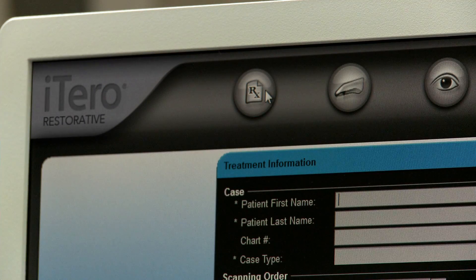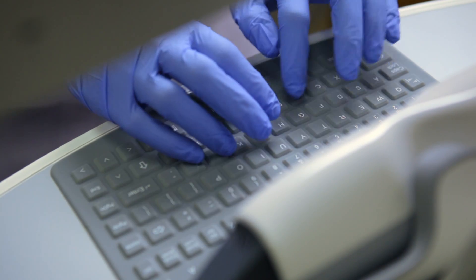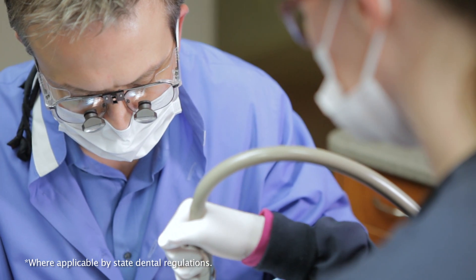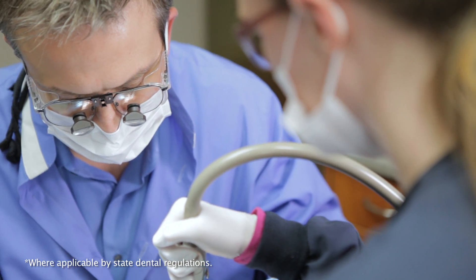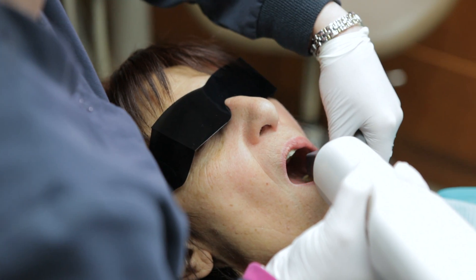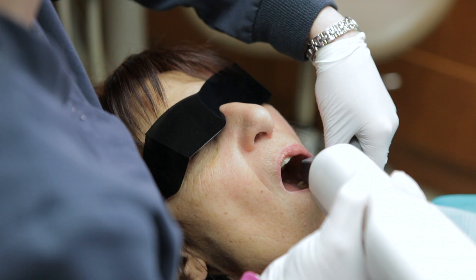Scanning for restorative treatment begins with a simple prescription form on the iTero system and an opposing arch scan. Both of these steps may be completed by an assistant, freeing up the doctor to attend to other tasks. The guided scanning process and the ergonomically designed wand make scanning easy and comfortable for both operator and patient.